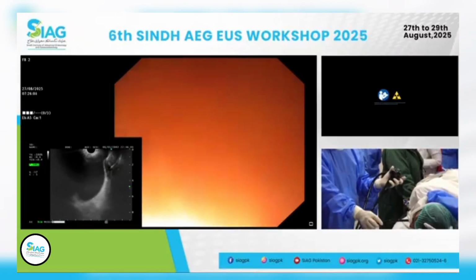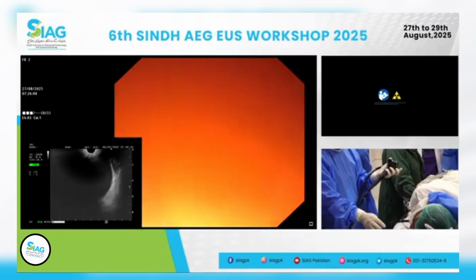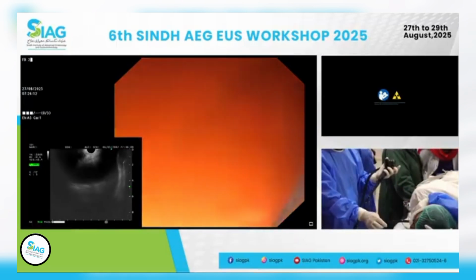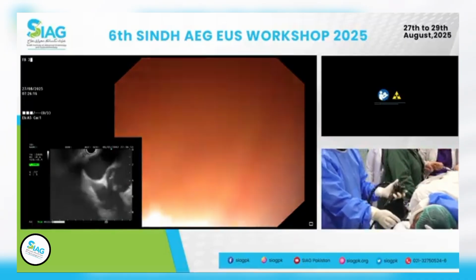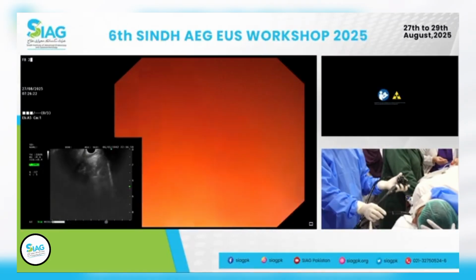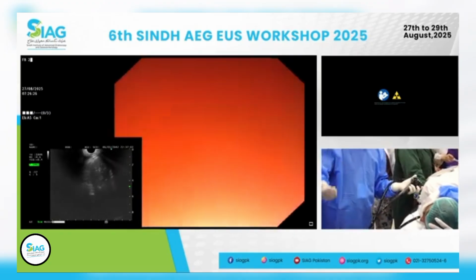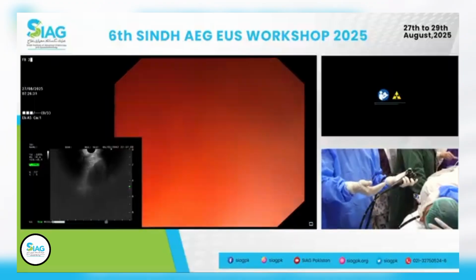Okay. So the way I'm moving the scope through the esophagus is I'm moving gently with my hands. Look at that, rotating the scope, and then going through the esophagus very gently. You have to be very gentle going through the esophagus. Some elderly patients may have a stricture and they don't mention anything about dysphagia, and you don't want to just rip through that stricture and cause a perforation.